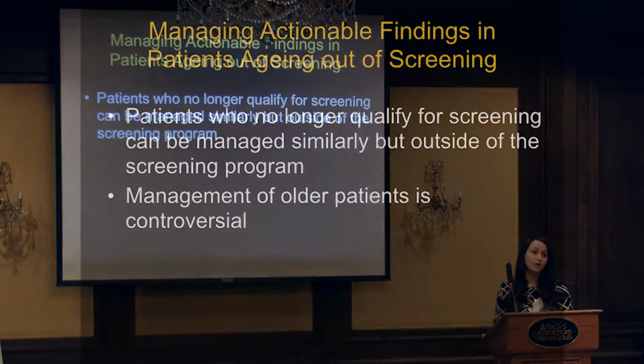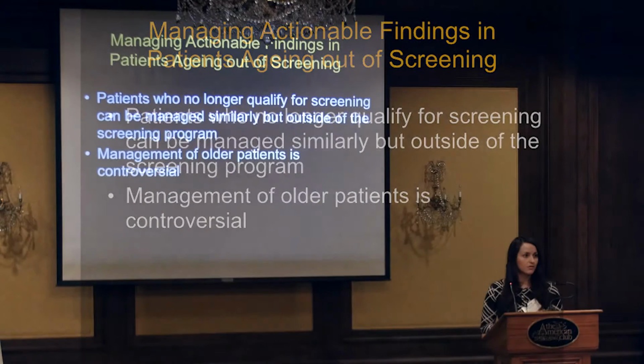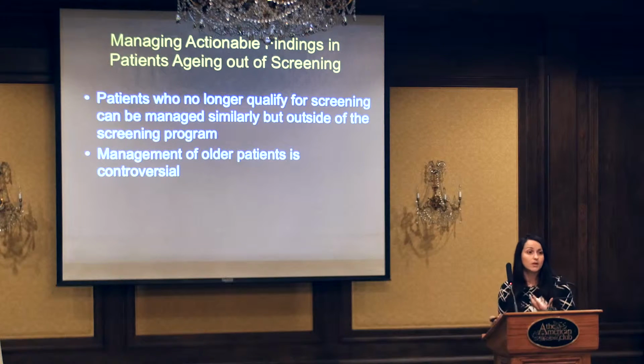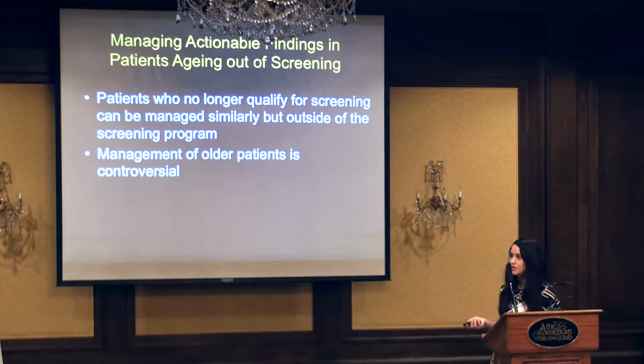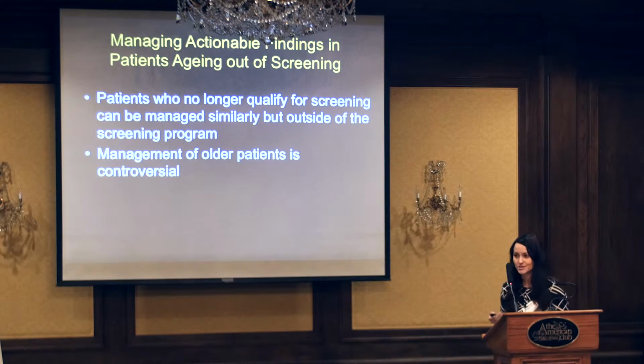Well, you can still follow these nodules with non-contrast chest CTs and keep your Lung-RADS recommendations because they're the least aggressive recommendations compared to Fleischner. However, we all know that these patients at 80 have tons of comorbidities. So this is your chance to talk to your clinicians and tell them, hey, this is new, this is what Lung-RADS recommends, but talk to the patient and see whether or not she or he will be amenable to treatment should something happen to this nodule. But just don't leave it blank, because this just causes more confusion and people to hate Lung-RADS more than they should. I mean, this is just trying to help patients.